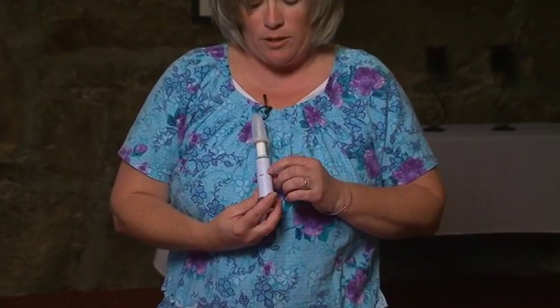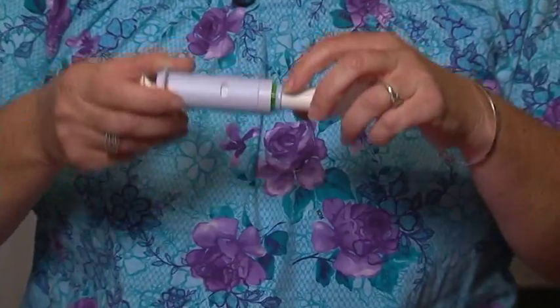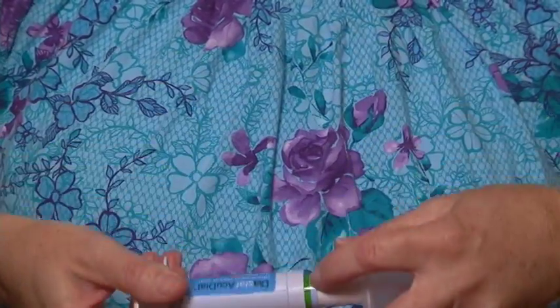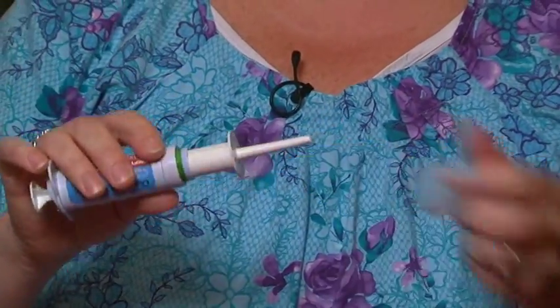That means checking to make sure the dosage is correct, making sure that the AccuDial is dialed and says ready, so there will be a green strip that says ready on it, and making sure the applicator tip is not cracked and it is attached.